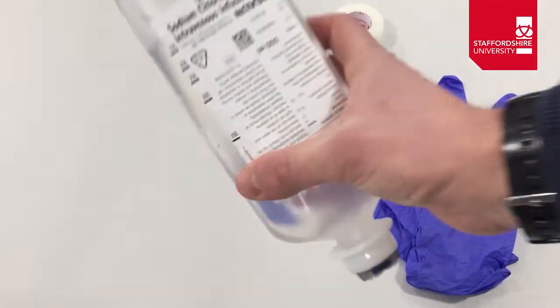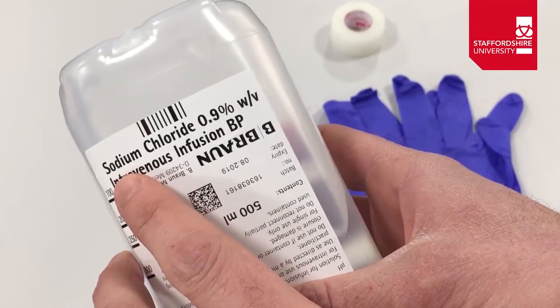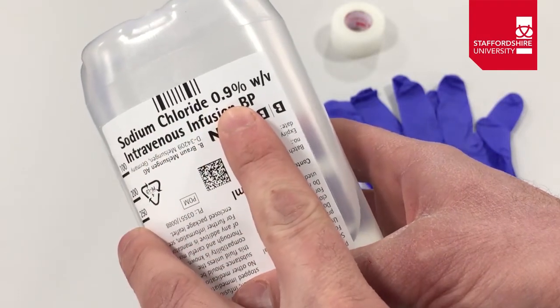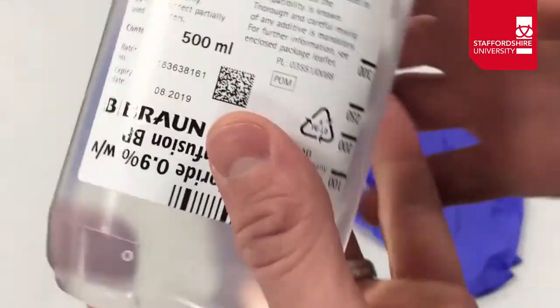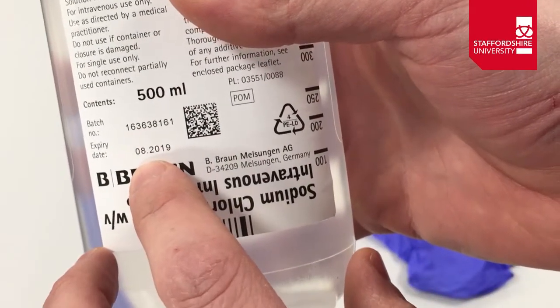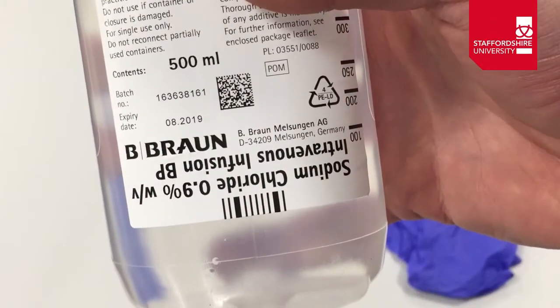We then do similar checks for the IV fluids themselves, with a few additional steps. First, we check it's definitely the right kind of fluid — we have sodium chloride 0.9%, which is what we want to administer. We also check the expiry date; there's a batch number and expiry date of 08/2019, so well within date at the time of recording.